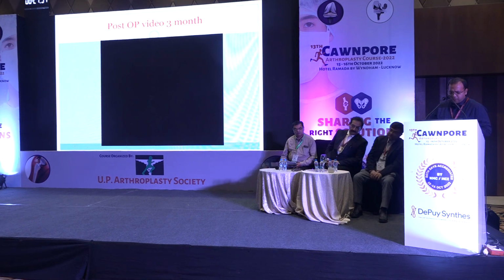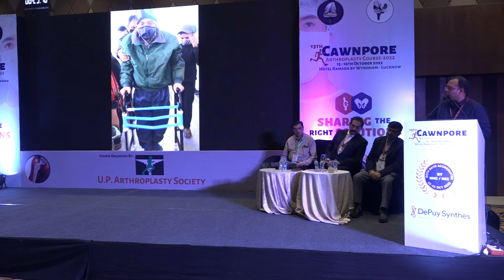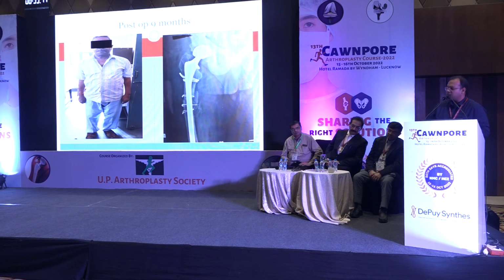I don't know if the video will play. So it is playing. He is able to walk with support at 3 months. I did not allow him full weight bearing, just to allow the fracture to heal. So this is at post-op 9 months. He is well, functioning well. His implant is uniting. There is callus formation on the medial side and laterally.